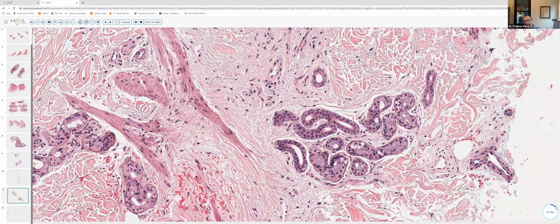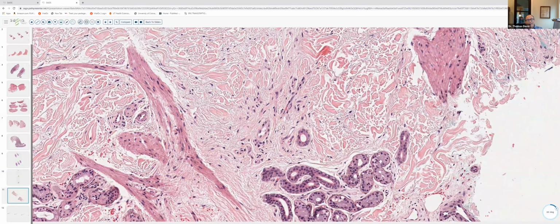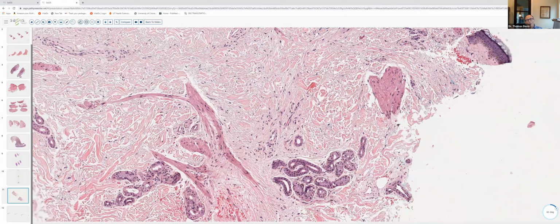And so if you see Argyria on the pick list of a test, or if you're thinking about it, you want to make sure you hone in on the basal lamina of the sweat glands. Occasionally, you can also see the material in the basal lamina of vessels. I didn't see it in this particular biopsy specimen, and rarely it will start to deposit on elastic fibers in the skin. But mainly, you're going to see it around the eccrine coils, and it's a very pauci-inflammatory condition. So it really enters into that differential of nil diagnosis or normal skin diagnosis.